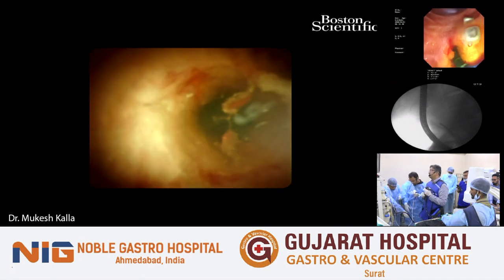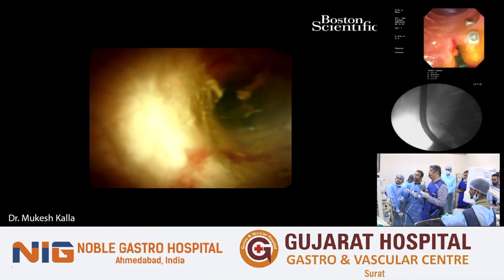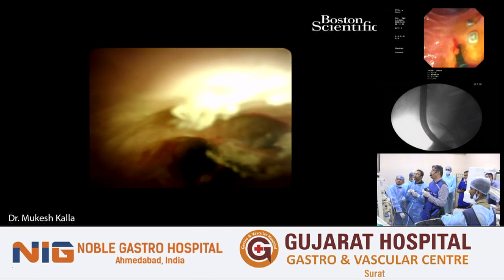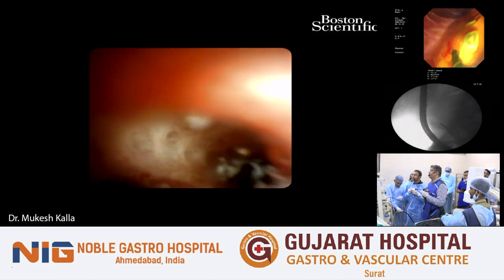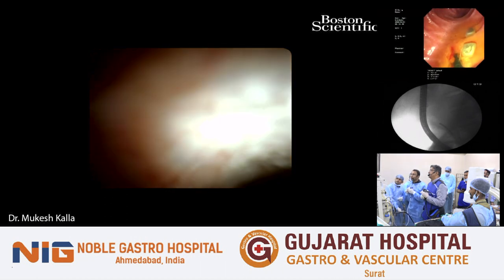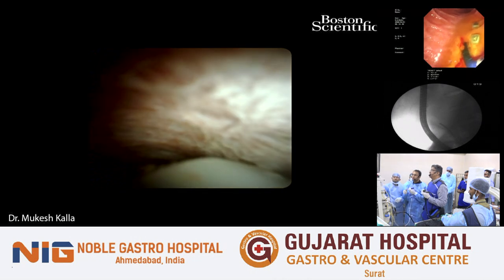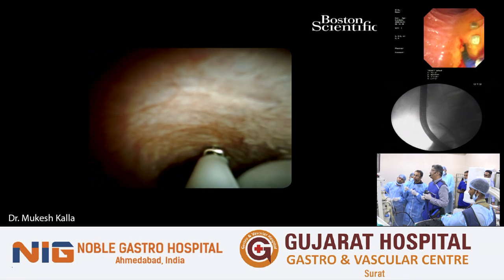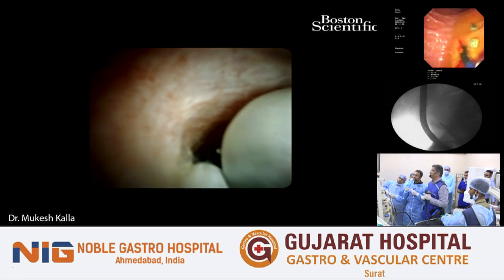I think it is above, turn it, go in there. I will manipulate. Yes. So this is like selective introduction of the scope inside the duct. You're able to go in? Yes. Go, open. Open better. Yeah, open. Wonderful. Very nice.